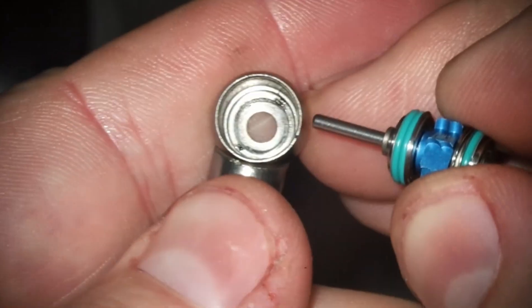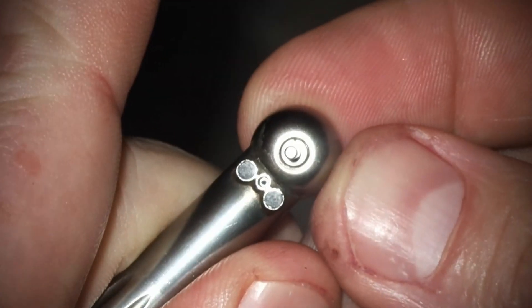So pop that turbine back in. Make sure that it looks good and that it spins freely. Sometimes there can be little impediments along the inside that you need to remove.